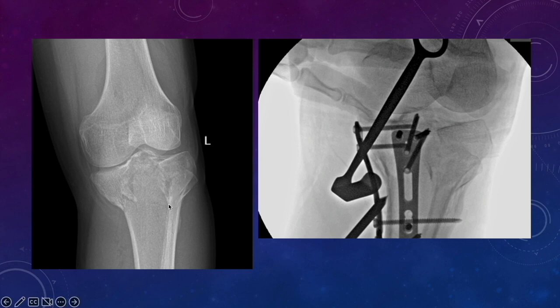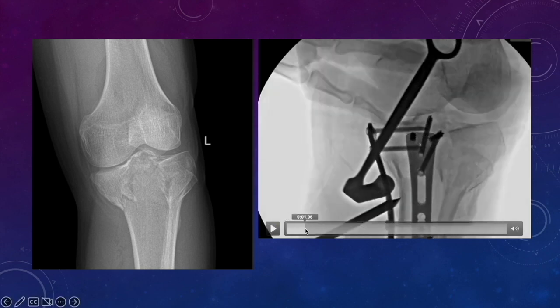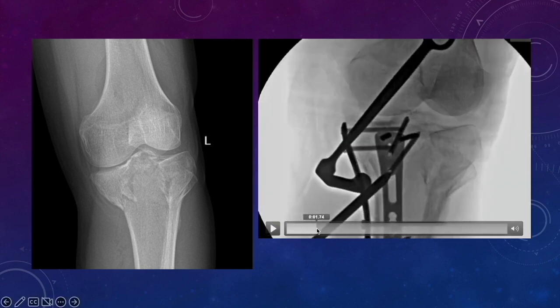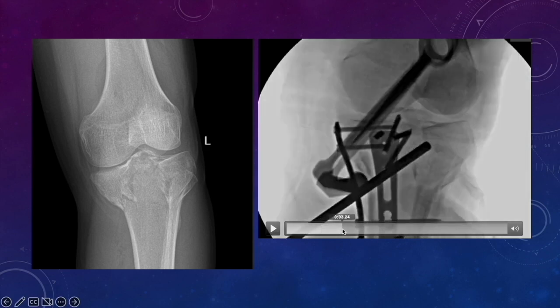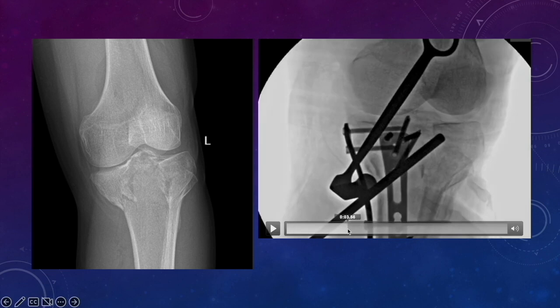In that scenario, you have to make the entry of bone punch either through the medial window somewhere here or through the medial condylar fracture. If there is some combination, that will be helpful in reducing this fragment. You see here, we are going through the medial side. We have made an entry through the medial side, and then we are lifting the bone fragment through the medial side only. You see, we have reduced it properly, and that has not hampered the reduction of the lateral condyle because there is no instrument to block the reduction of the lateral condyle in this space.